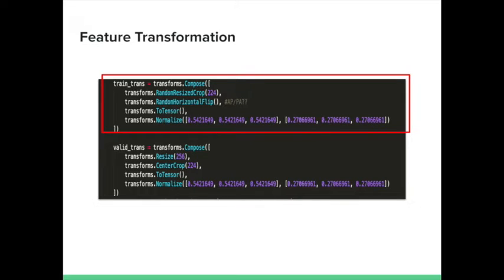The next step is to perform horizontal flip. The intuition behind doing that is that an object should be equally well recognizable as its mirror. Now, specifically in the case of chest X-ray images, we recognize that the presence of symmetry about the y-axis exists. So we consciously chose not to perform vertical flipping, as the lung X-ray images are not circular and not symmetric. However, in the case of the model, we incorporated the feature AP/PA, with which the horizontal flip was taken care of.